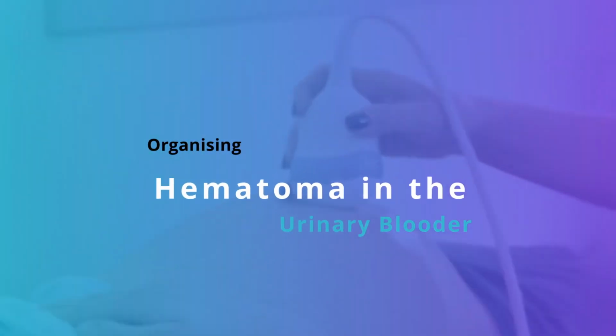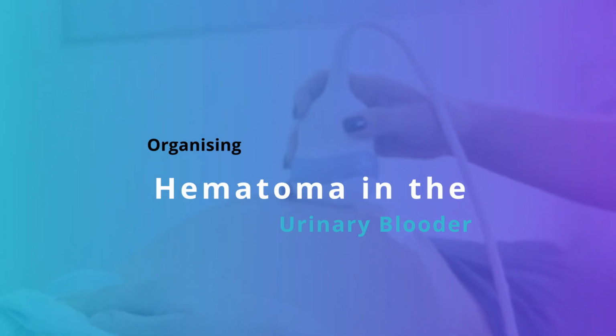In this presentation, I am going to discuss what is called an organizing hematoma in the urinary bladder.